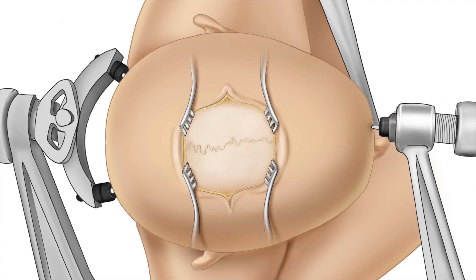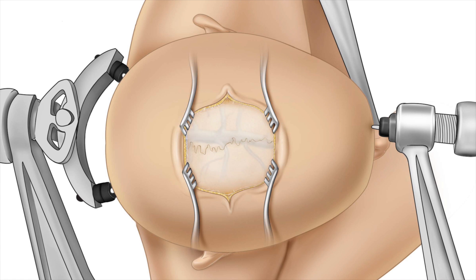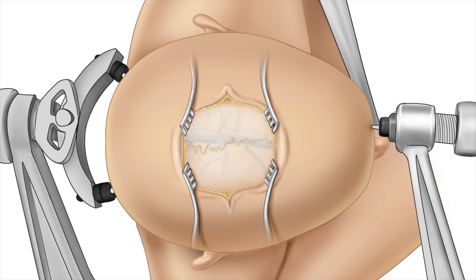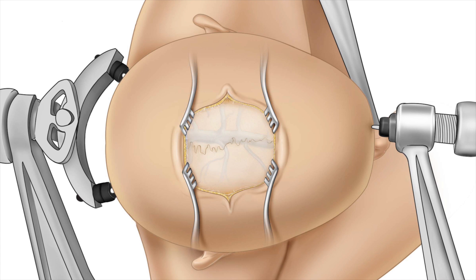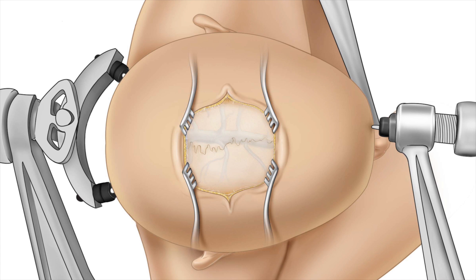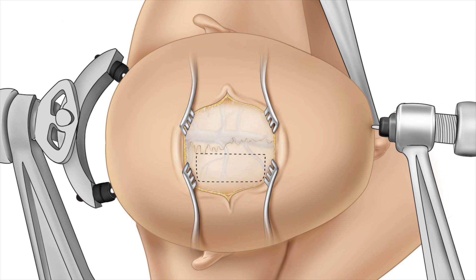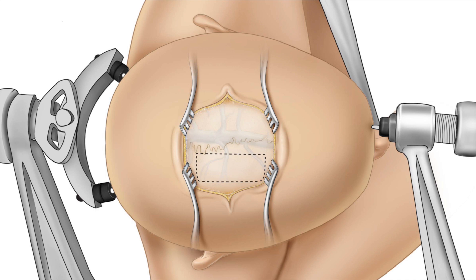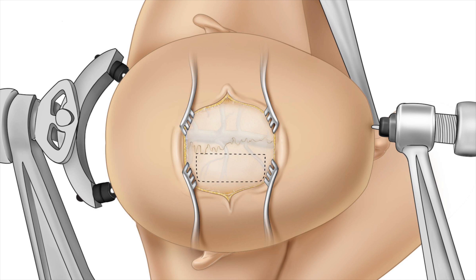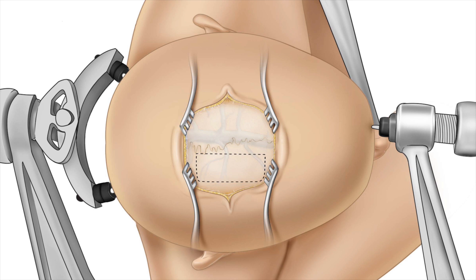Once this exposure is complete, you can appreciate the sagittal suture, which is a fusion point between bones of the skull. This is an important superficial landmark for the underlying superior sagittal sinus, which is a large vein that drains much of the brain. It's important with this approach not to damage this vein, as this can cause a life-threatening stroke.